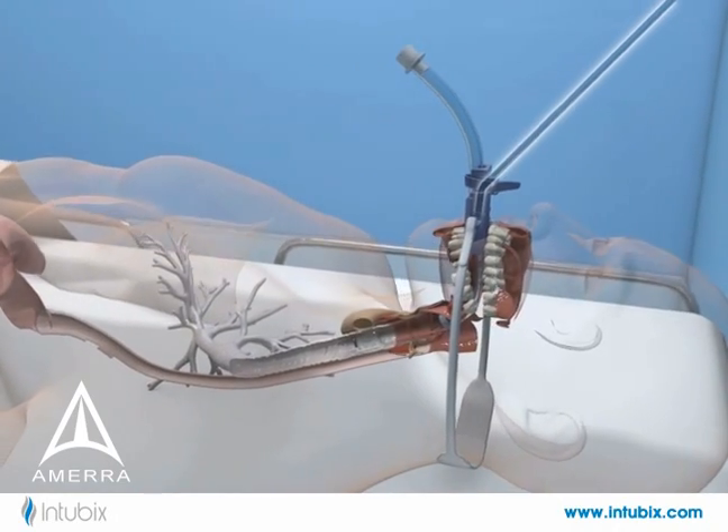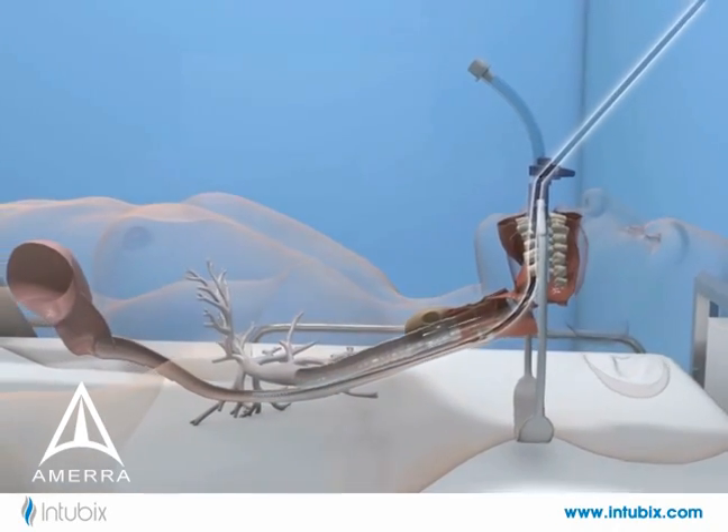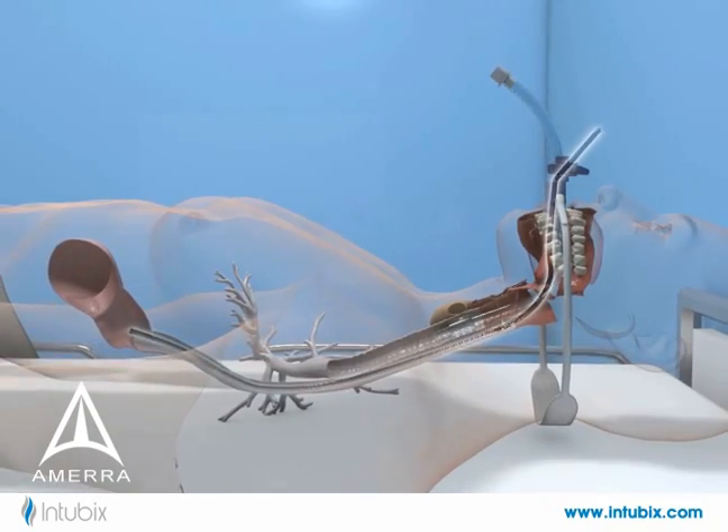Inserting an oral feeding tube into the side port allows blind passage of the OG tube directly into the esophagus and then into the stomach.